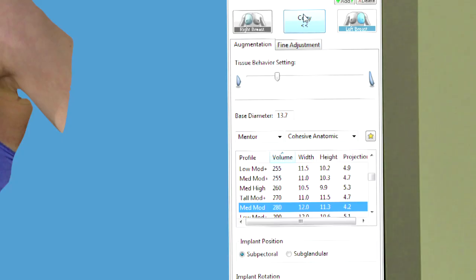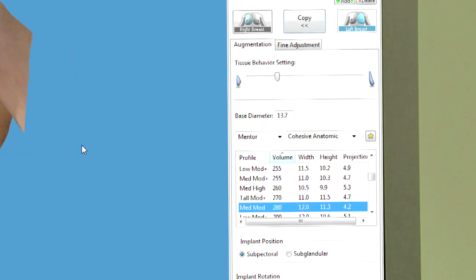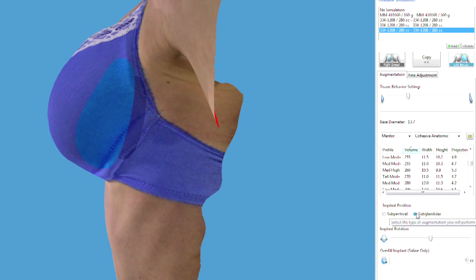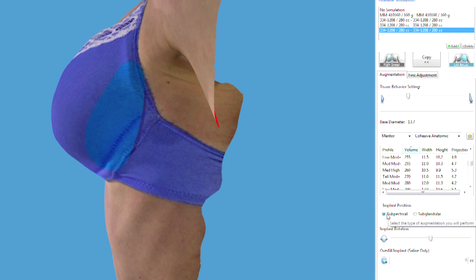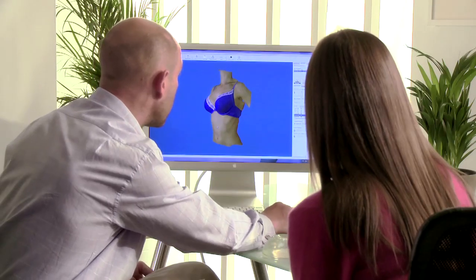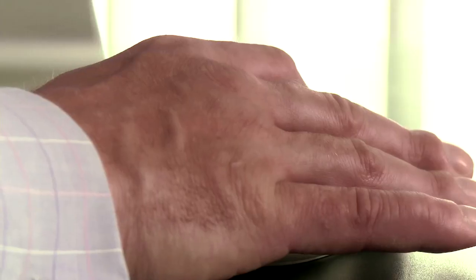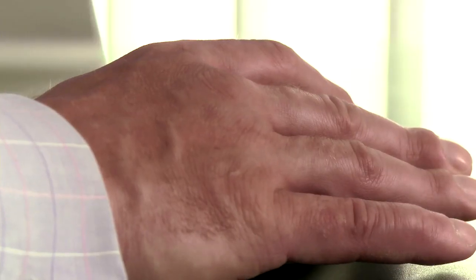Select implants for a simulation from the major manufacturers' catalogues. Sort and select by implant size, type or profile. The software automatically places the implant in the pocket in a typical position for either sub-glandular or sub-pectoral placement. You can easily customise the simulation to your style of surgery using fine adjustment tools.